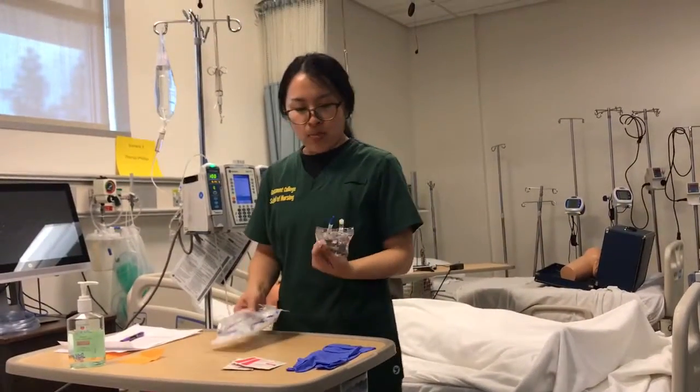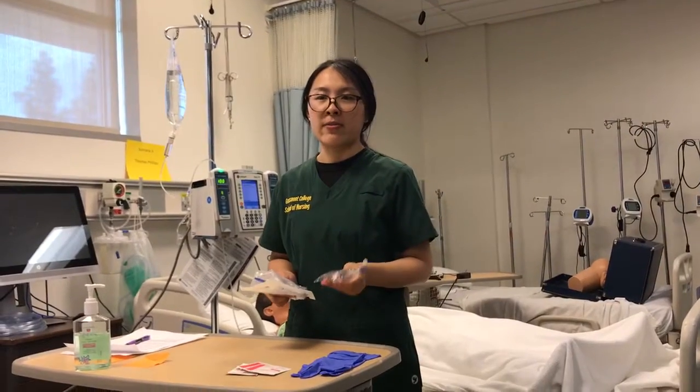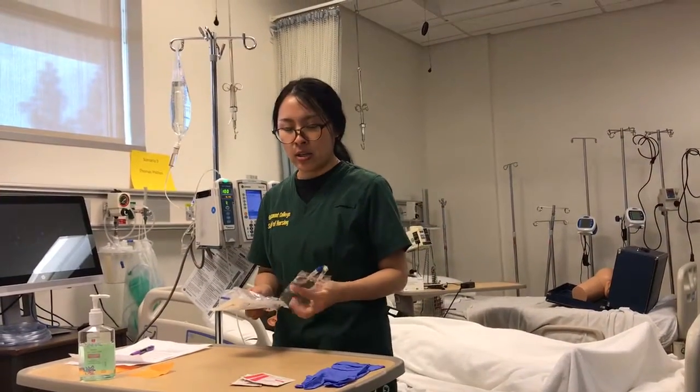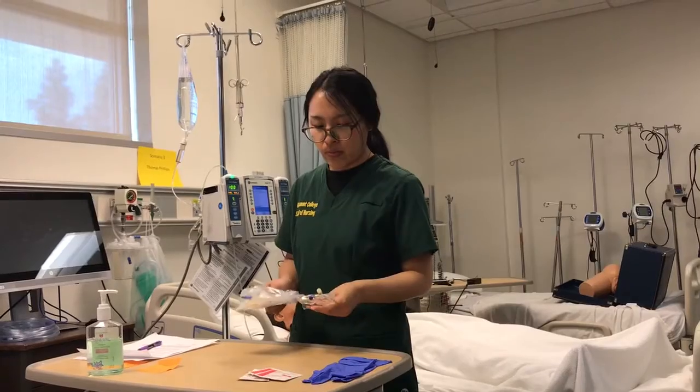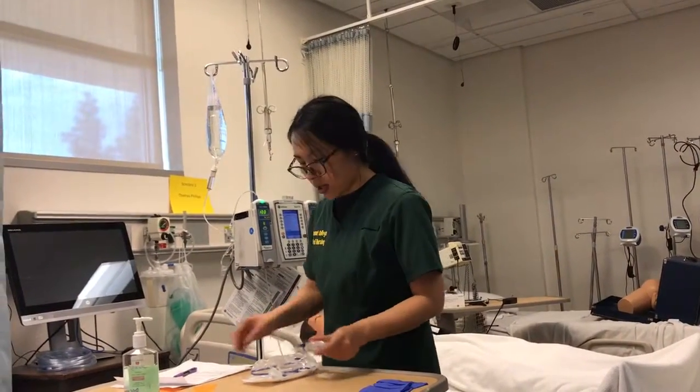Okay, so I got my medication in the Pyxis. Also, I did my first and second checks in the Pyxis and the preparation room. Now I'm going to do the third medication check at the patient's bedside.